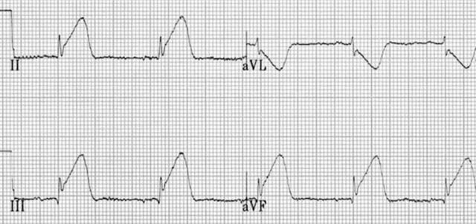Good morning, everyone. Thank you for your rapt attention. This is a little bit of a follow-up to a medical minute I did the other day, although I think it was a different crew. So we were talking about how you can tell on an EKG what region of the heart is affected when you're looking at a STEMI.